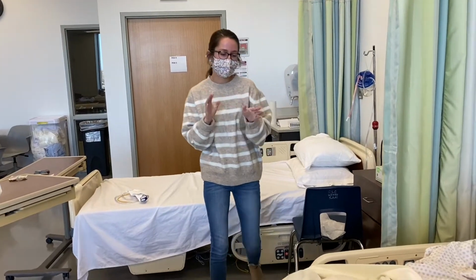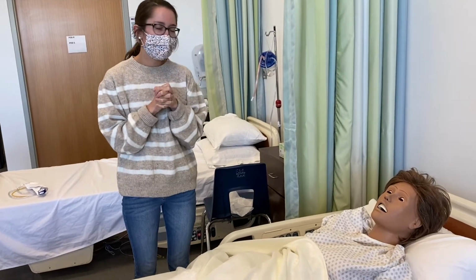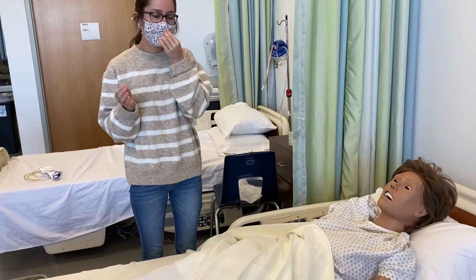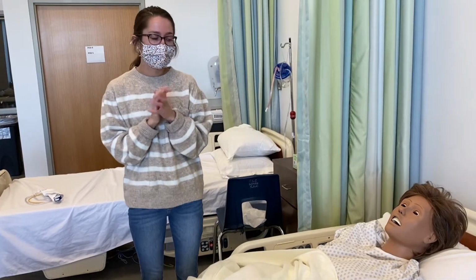First, I'm going to walk into the patient's room and introduce myself. I would say, hi, I'm Savannah. I'm going to be your student nurse today. I'm going to assess their overall condition, assess if they're able to cooperate and hold still during the procedure today. I'm going to assess if they're able to lay supine and flat with their head laying flat.